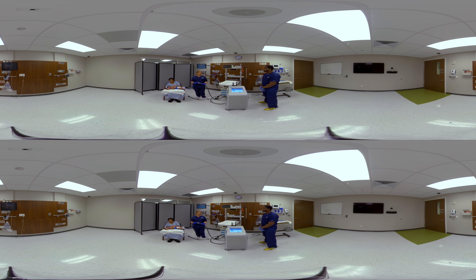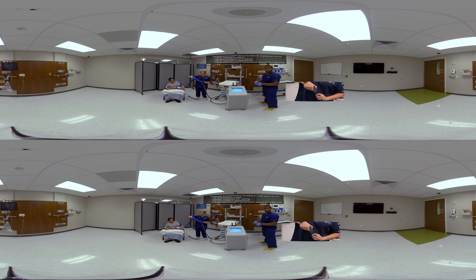Once the empty pad screen goes away, then you know you can safely disconnect. In order to disconnect the pads from the fluid delivery line, first you will squeeze the clear tabs, you will push in until you hear a click, and then you will pull apart. So that is: squeeze, push, then pull.